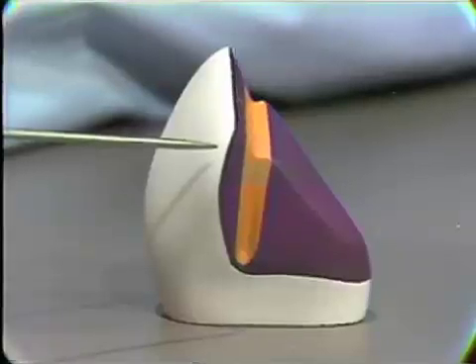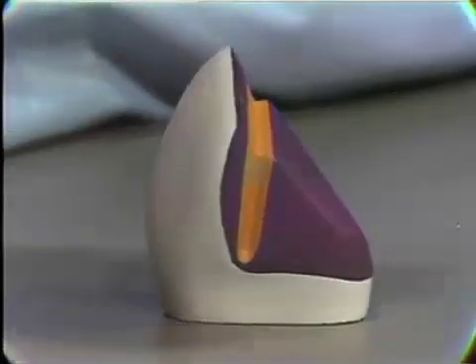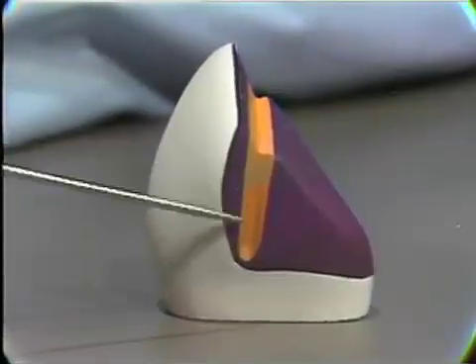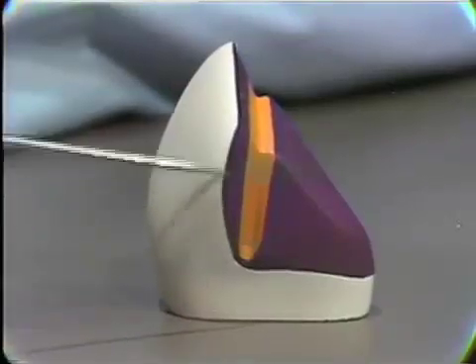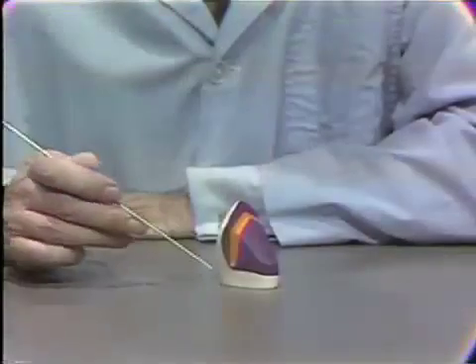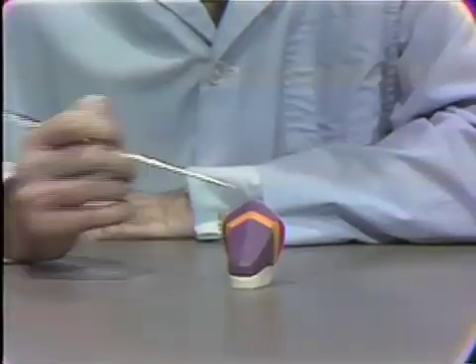And this is one of the great advantages of the pin ledge preparation. As you know, of course, it gets its retention from pins on the lingual surface, not on the proximal, and you have more or less complete control of the proximal design. And if you want, you can stop the preparation much further back in the proximal area than you would with a three-quarter crown. So for this reason, the three-quarter crown is being used less and less in anterior teeth.